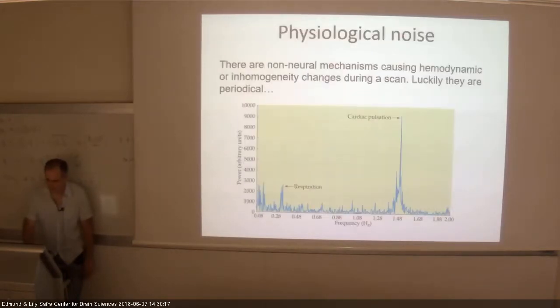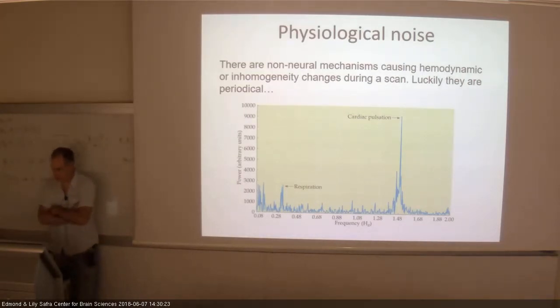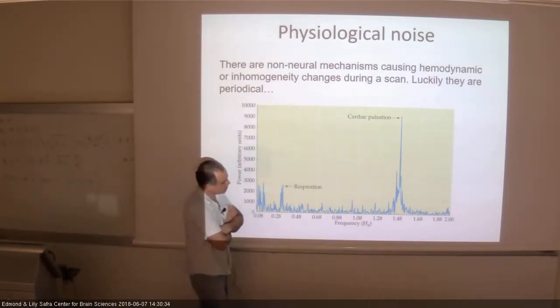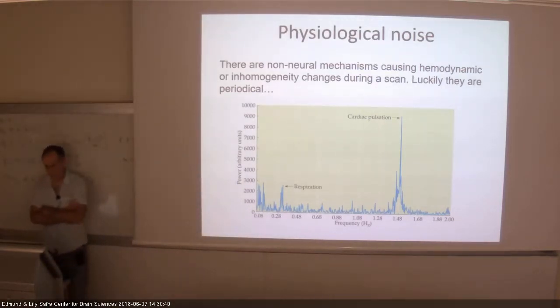All right. So I'll go over these briefly. I don't want it to fill the whole day, but we do remove some of this noise. So again, like we said, we have this periodic noise, which is respiration, cardiac pulsation, among others, and the way you treat these are, a lot of people just ignore this, actually, okay?